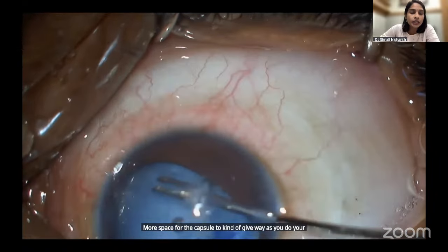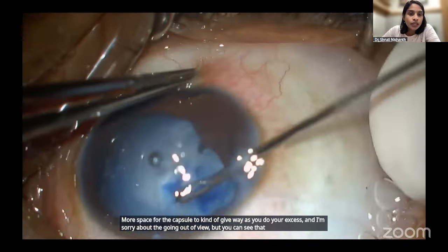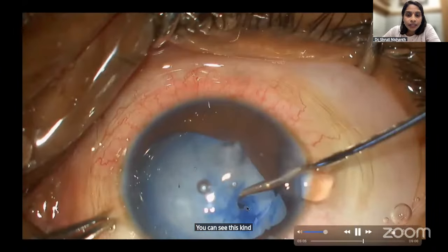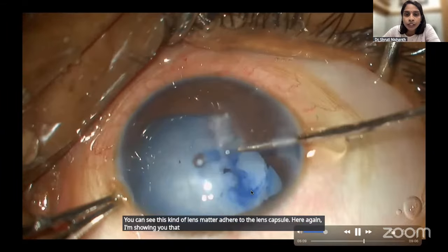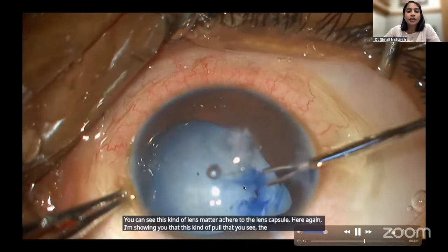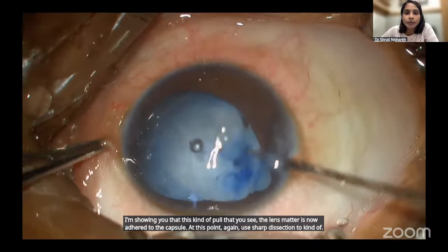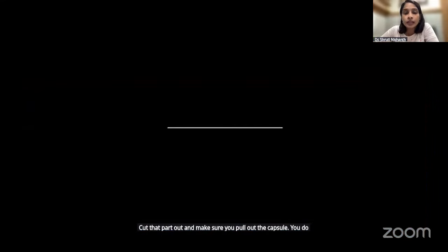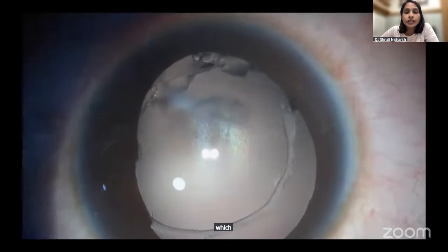I'm sorry about the going out of view, but you can see that as I'm coming back, there is lens matter adhered to the lens capsule. Here again, I'm showing you this pull that you see; the lens matter is now adhered to the capsule. At this point, again, use sharp dissection to cut that part out and make sure you pull out the capsule. You do not necessarily need a round rhexis in this. As long as you have a good rhexis which is intact, and you can put in the IOL, it's good.